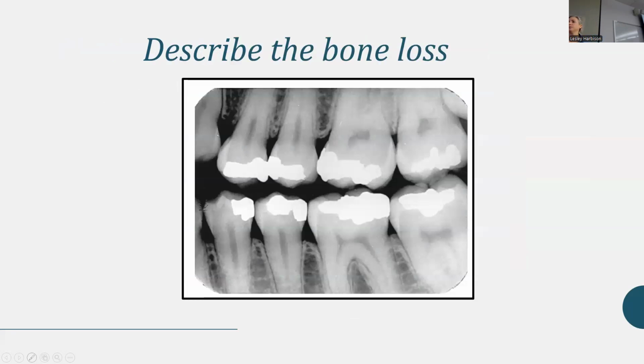What about this one? This one's a little bit tricky because honestly, this person is likely healthy. I mean, you can see their lamina dura. This one, it almost has a little bit of a funky little texture, but you can still see the lamina dura. So sometimes, and like here and here, I think that's just a density issue.